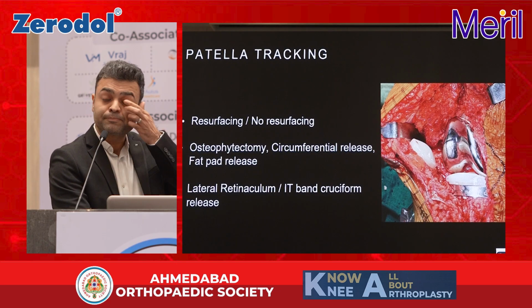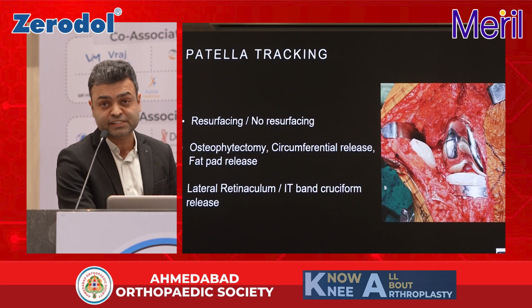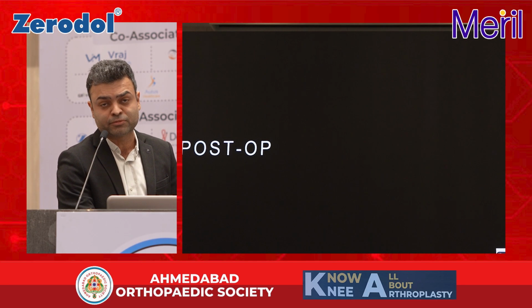The important thing is patella tracking. These patients have significant lateral patella tracking. So if you're doing resurfacing, it will help. You remove the lateral osteophyte and your tracking improves. Some patients do require a lateral retinaculum release.